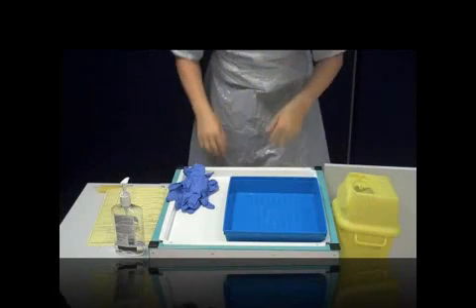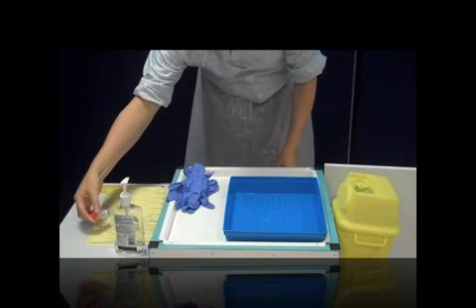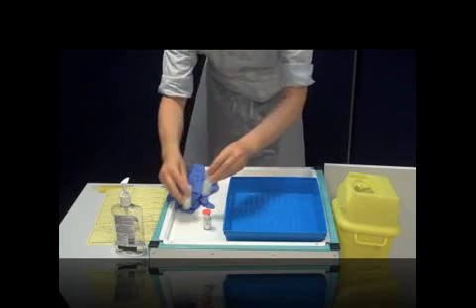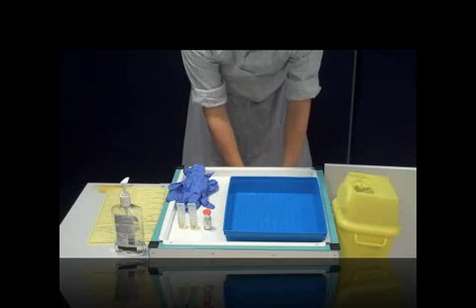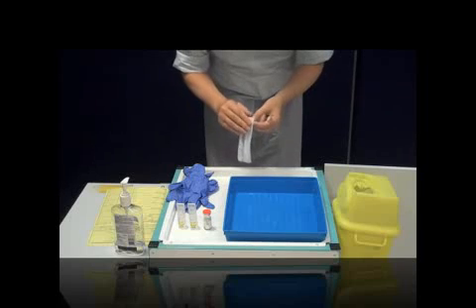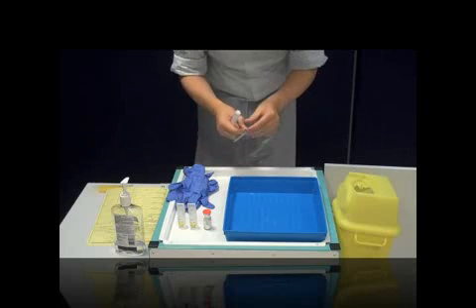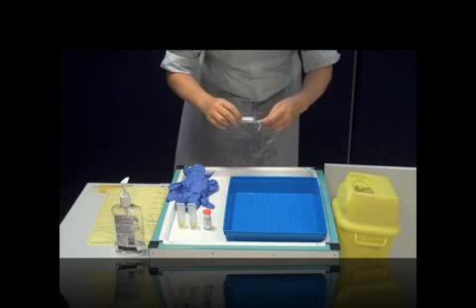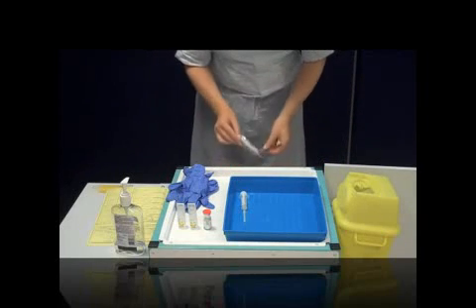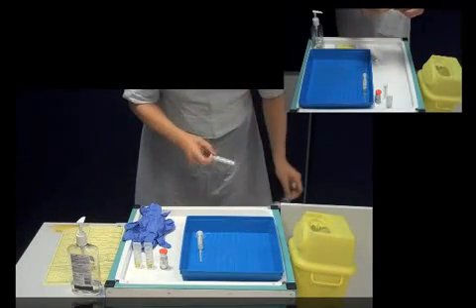So begin. Put on an apron, wash your hands and clean the ANTT tray, and then wash your hands again. Get out your equipment. So there's the antibiotic, there's the diluent for the antibiotic and a flush. Take the syringe and attach it to the needle. That protects your key part so it can go in the ANTT tray. And then repeat with another one. The first one's for drawing out the flush, the second one is for drawing up your antibiotic.